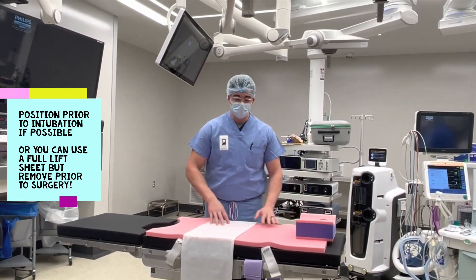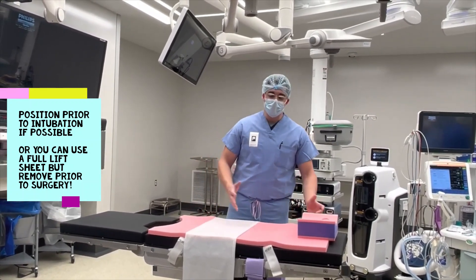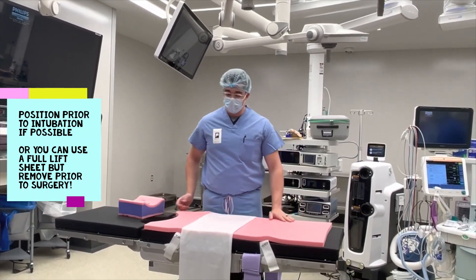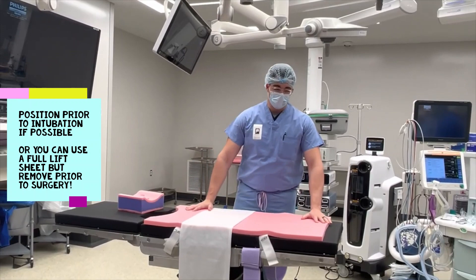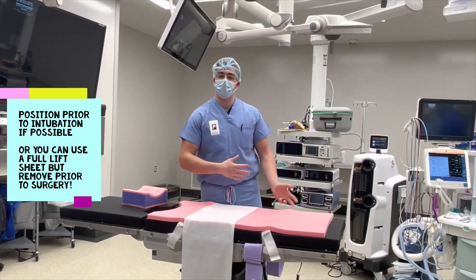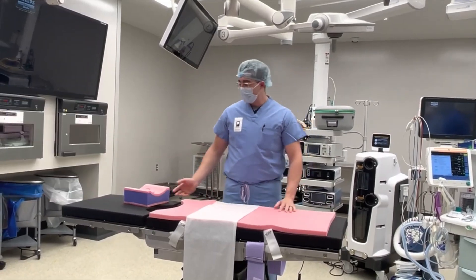If you have to move them up and down and they are a bariatric patient, it is going to be harder to move them on here. What you can always do is just throw a full lift sheet over this, intubate, move them down, then log roll them twice to get the lift sheet out. It's just a little tip or trick.